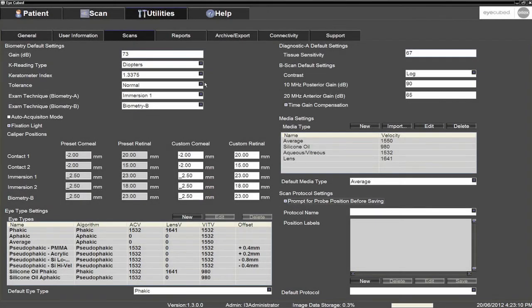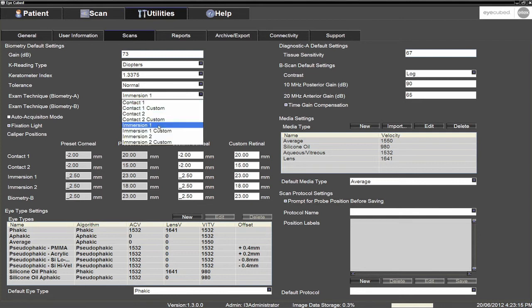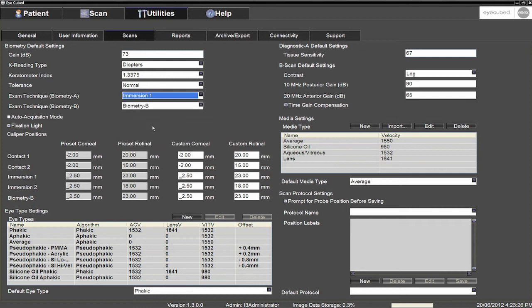Next, depending on whether the user will perform contact or immersion biometry, select either Contact 1 or Immersion 1 in the biometry A exam technique. Contact 2 or Immersion 2 can be used in the presence of shorter eyes, but should not be set as default settings.